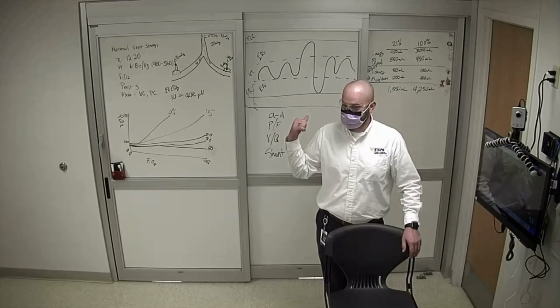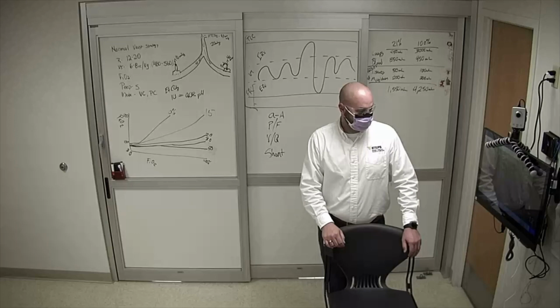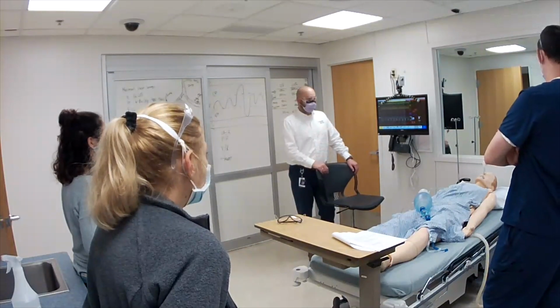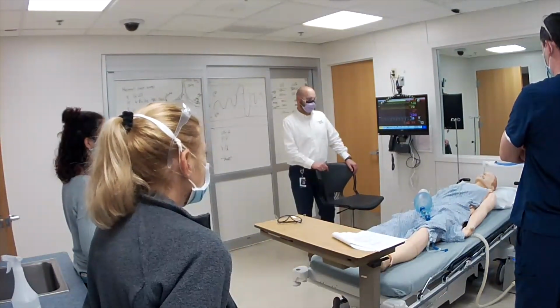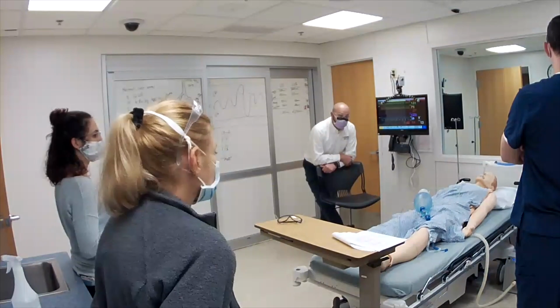Either a clot of some sort, or... So Shannon, tell me about what your vent's telling you. The compliance has changed for some reason. What's his mean airway pressure? Mean airway is still only 9. That's good, right? So there's nothing wrong with his small airways. Because if this were ARDS or something, you'd expect his peak pressure to be 39 and his mean airway pressure to be 30. You'd expect that to be pretty terrible. So we've got an isolated elevated peak pressure.